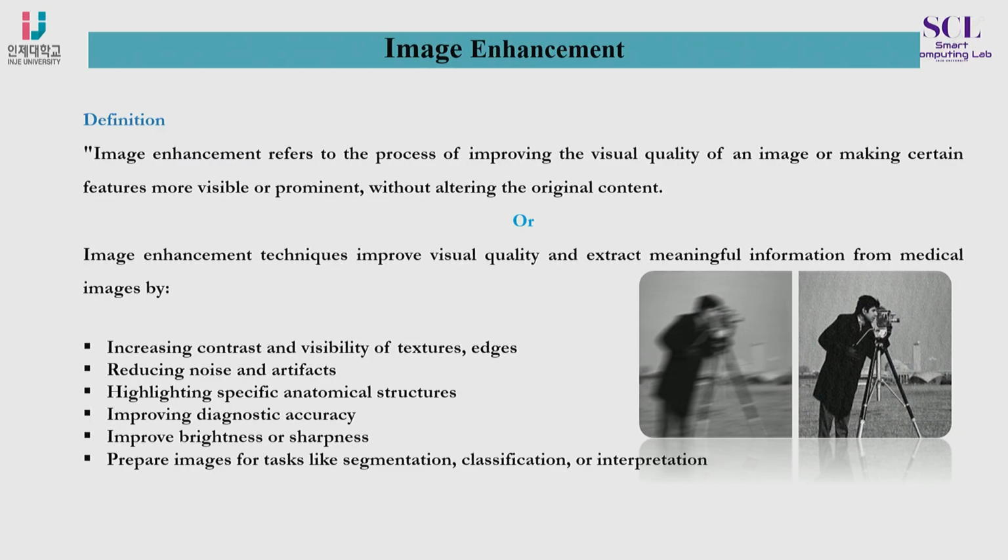So we can identify and interpret more information related to the image on the right side. So, increasing contrast and visibility of texture edges, reducing noise and artifacts, highlighting specific anatomical structures, improving diagnostic accuracy. So here you can see that we have increased the image quality, and there is a contrast. For example, we have increased the brightness and contrast of the image. You can see on the right side.